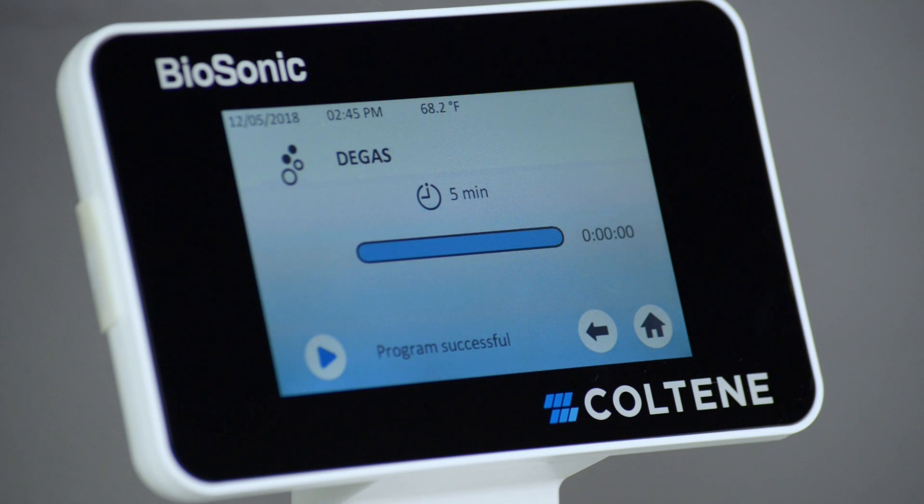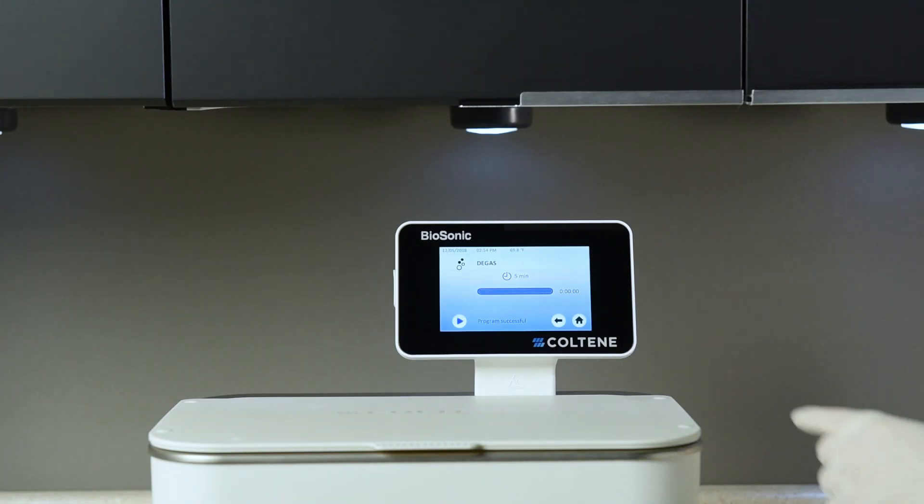The timer will count down from five minutes. Once the timer reaches zero, your solution is now degassed and ready for use. Press the home icon to return to the main screen.